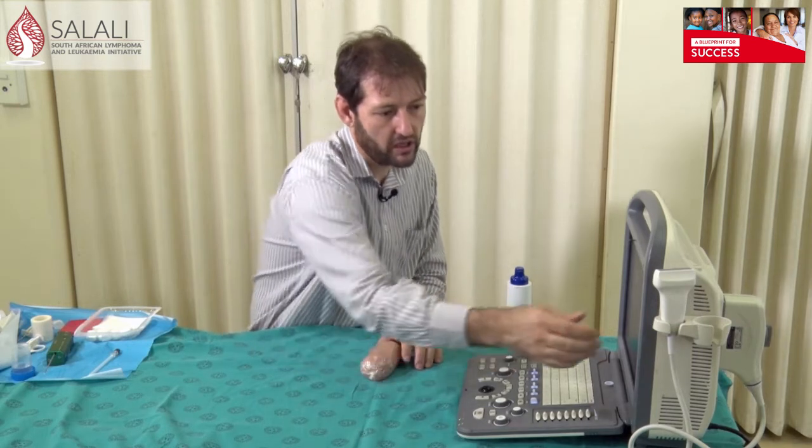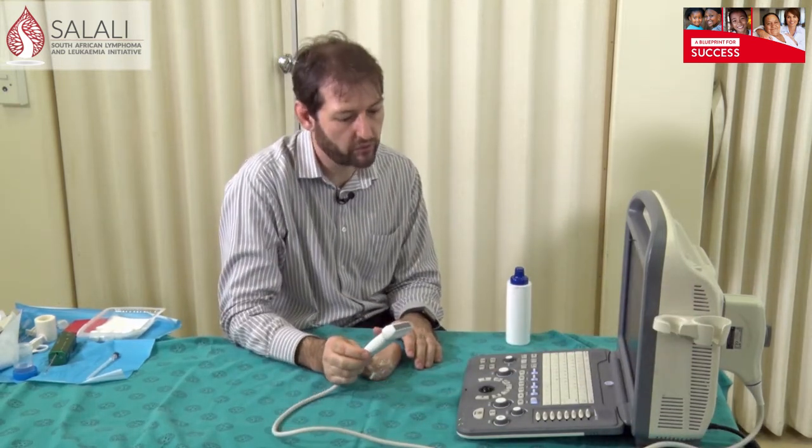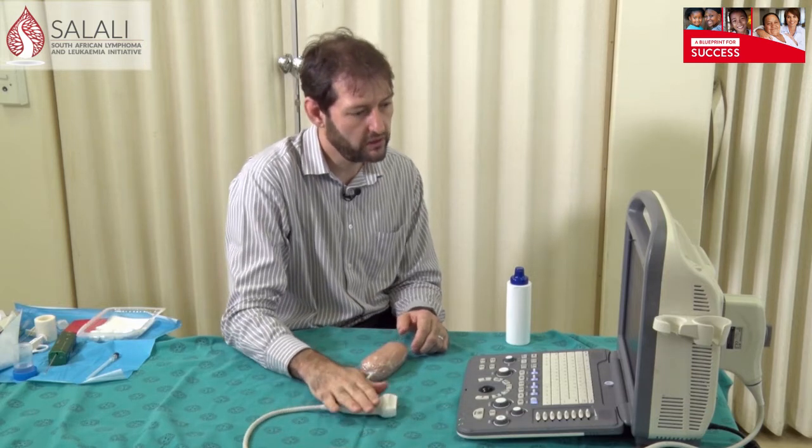Most of these soft tissue biopsies don't need a very high end ultrasound machine because you're mainly scanning very superficial tissues. This is our portable machine that we use in our breast clinic. You need the machine and also a linear probe, which has a frequency that is ideal for scanning more superficial tissues.